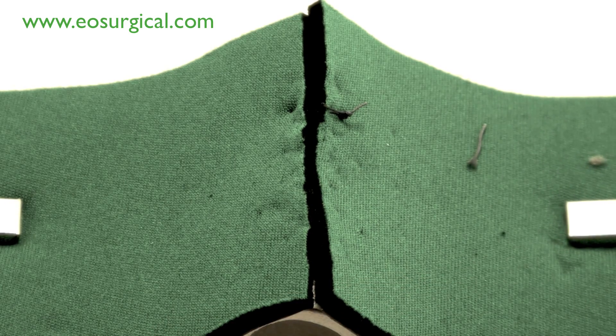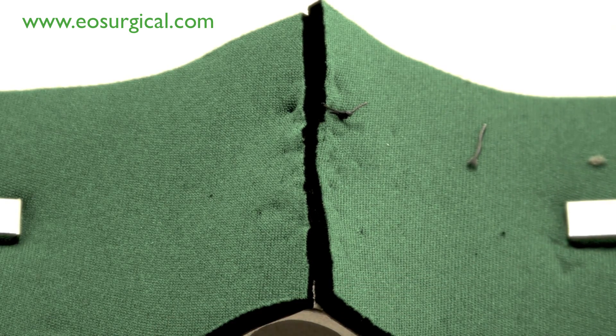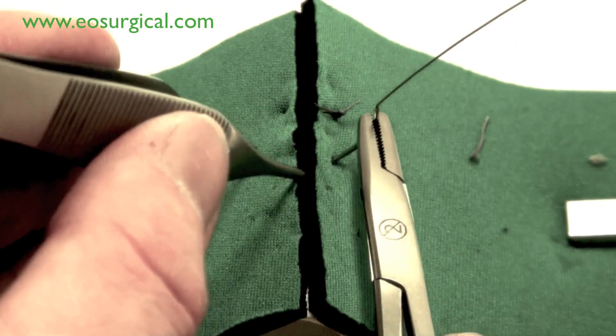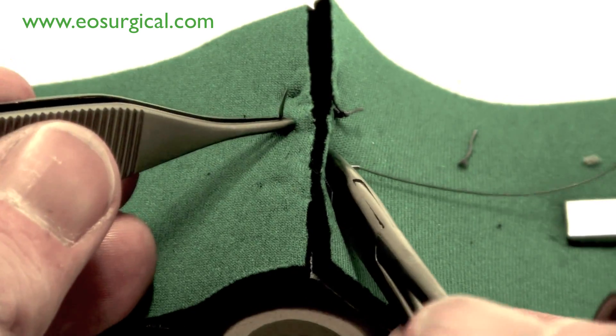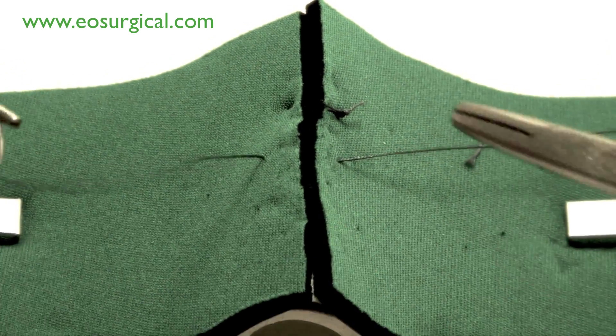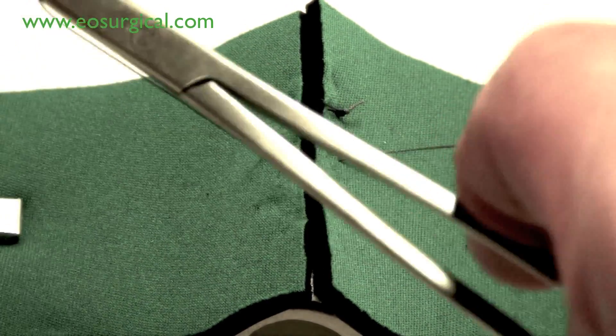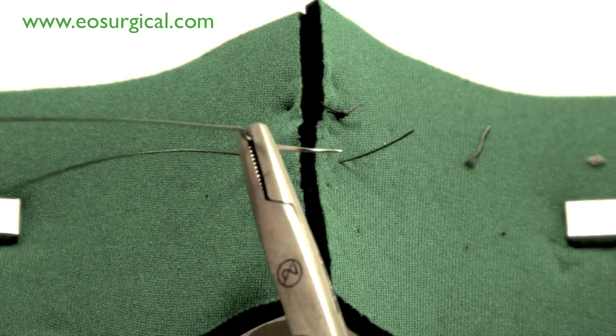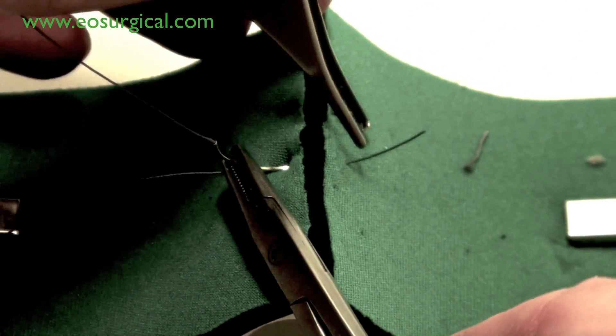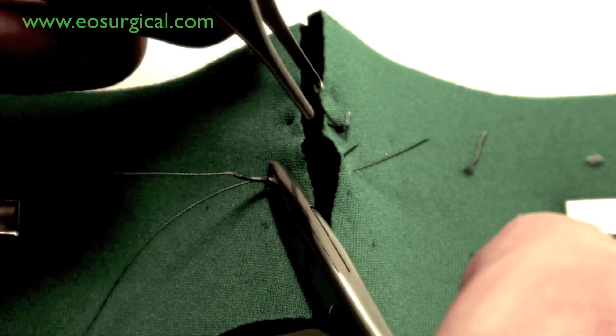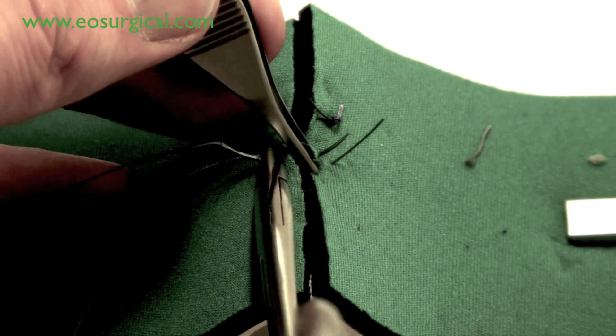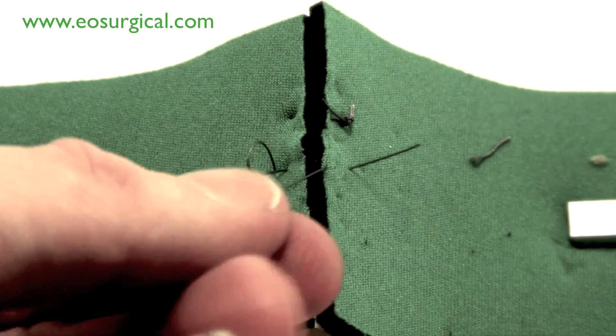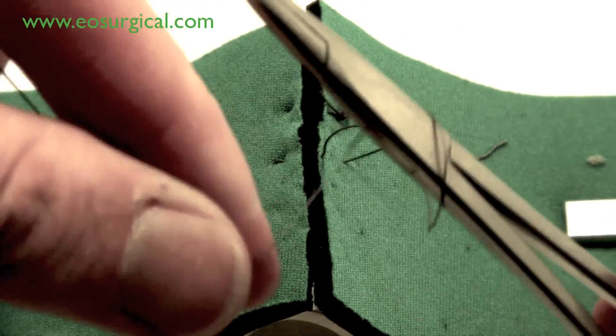Now let's see that same suture again. Starting it wide, passing it through the tissues before reversing the direction and then tying it again using a simple instrument tie.